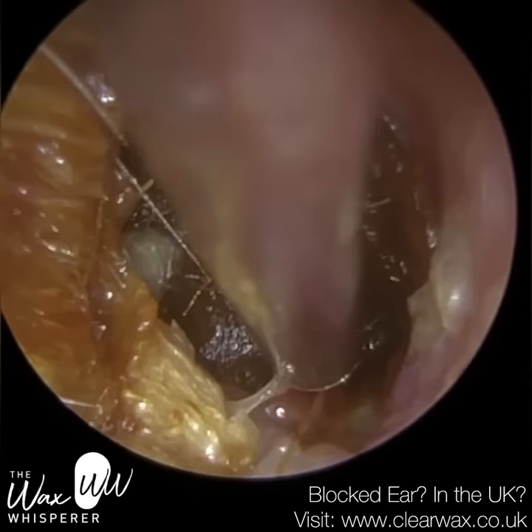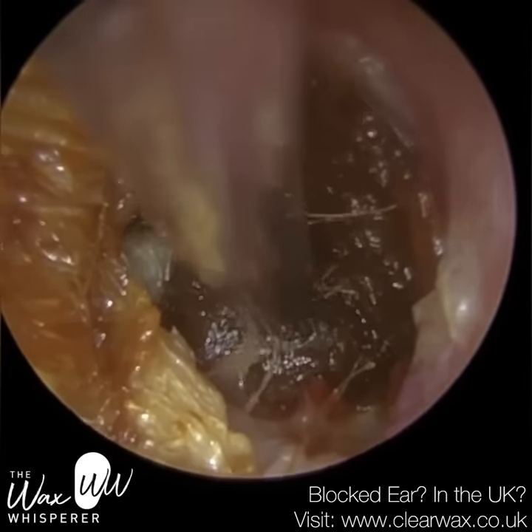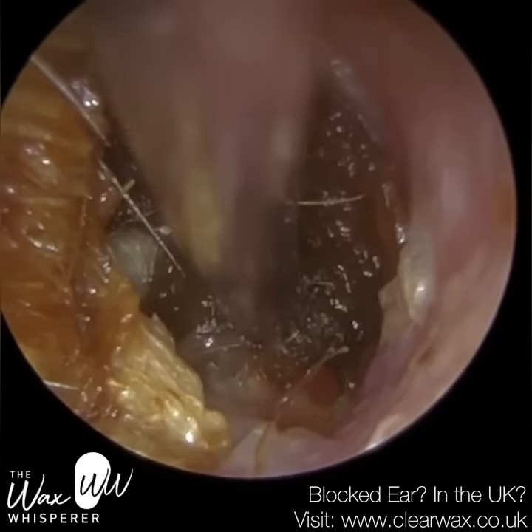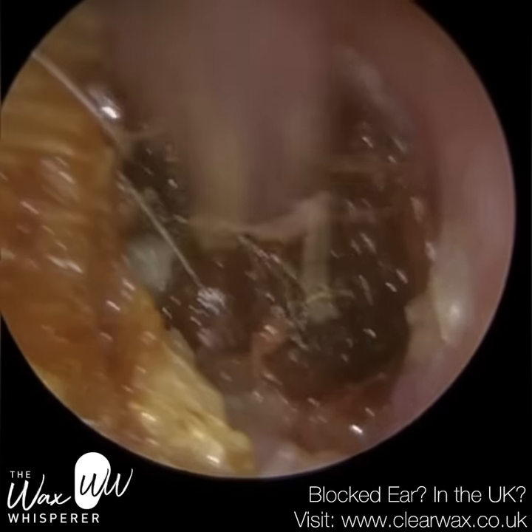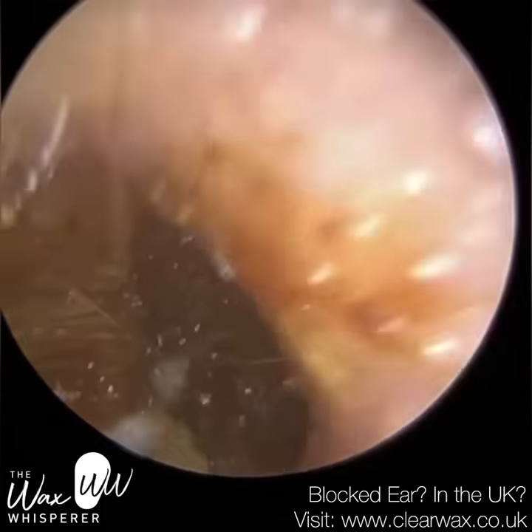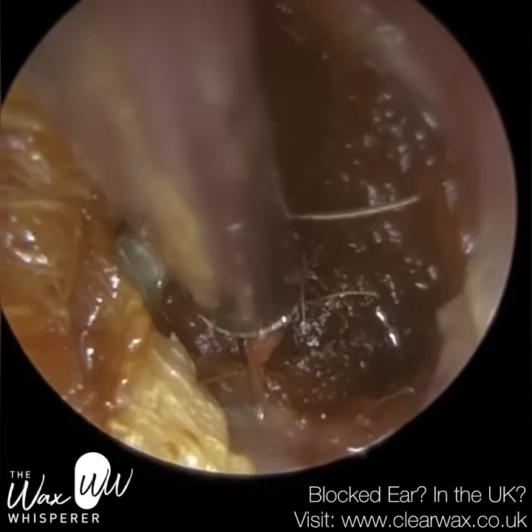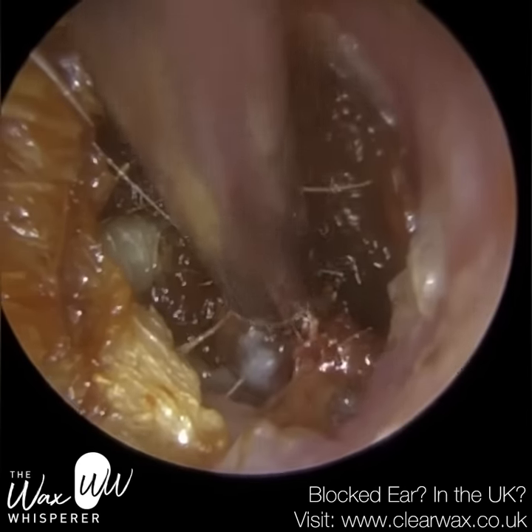You can see here this patient has got some granulation tissue. Granulation tissue is inflammatory tissue — you normally find it when a part of your body is undergoing some form of healing. So we know this area is experiencing trauma, and I think it was that water. I think they also used a cotton bud as well, so it was a double whammy. Granulation tissue is just a bit of connective tissue, and it has its own blood supply — hence why when you sometimes remove it, it looks quite fleshy.